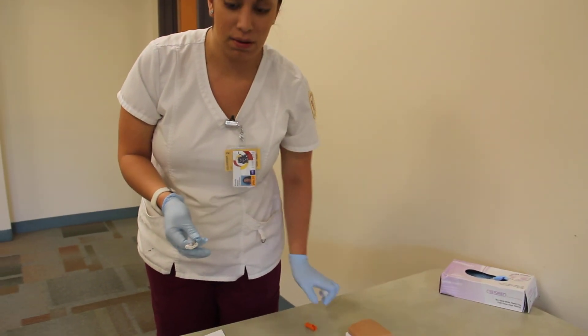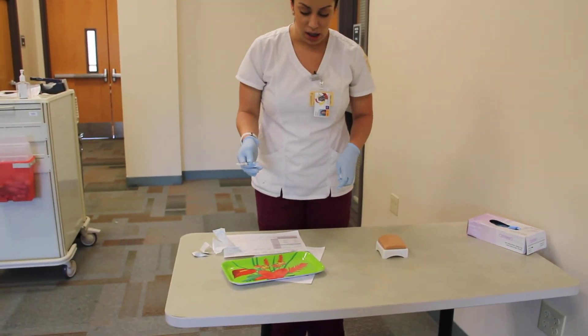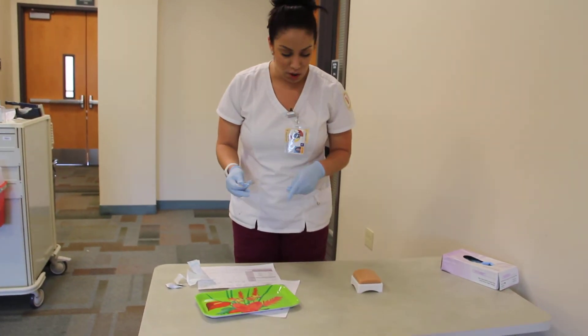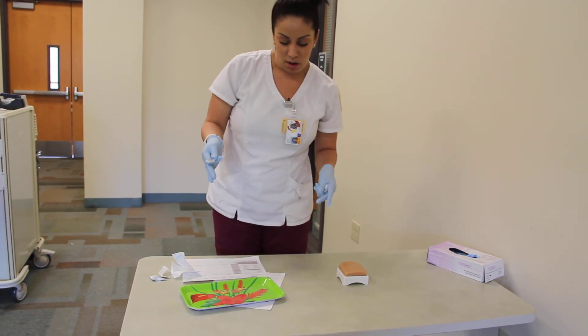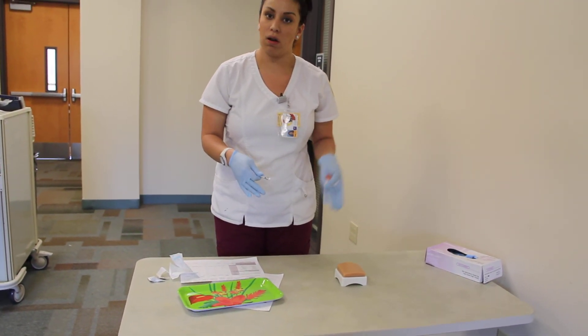I'm going to remove the gauze and put it in the garbage, put the syringe in the sharps container, remove my gloves, and wash my hands. I'm going to make sure my patient is okay, her bed is in the lowest position, and her call light is within reach.